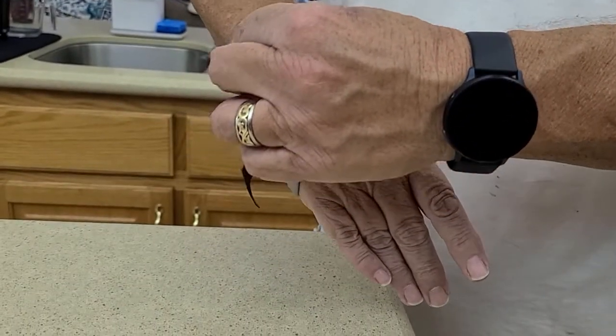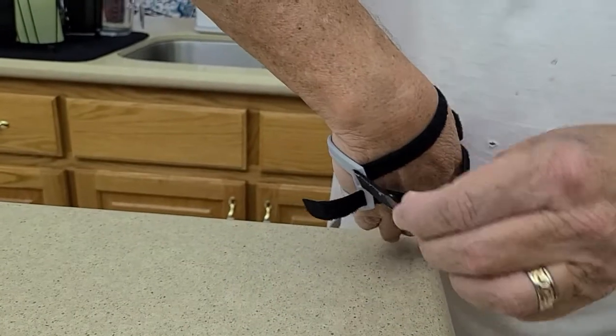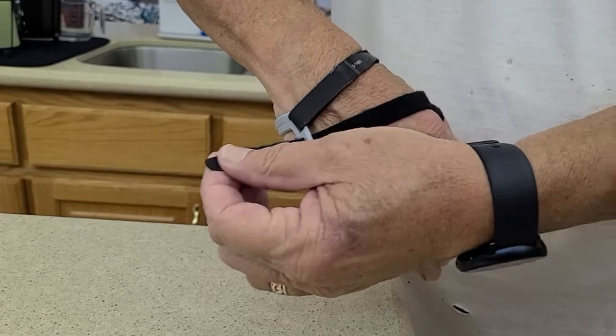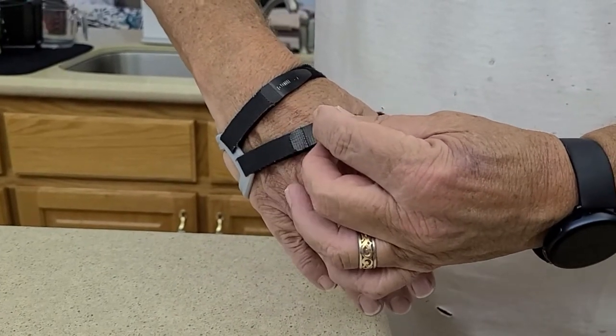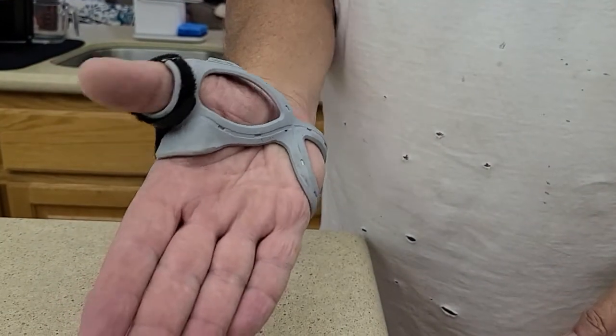You don't want this too tight, but you want it fairly tight. Then you take this and pull that across, and it's just Velcro so it stays. I always do this last strap last — you just pull that one and lay it down flat like that, and that's it. That's how it looks when it's on there.